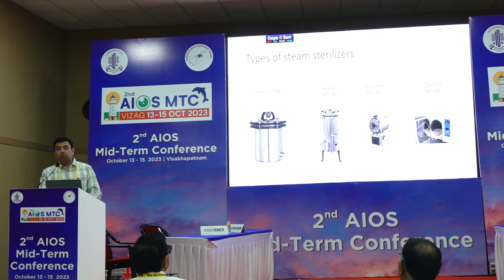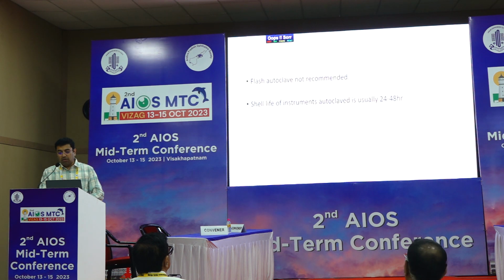So the B class autoclave is very highly recommended. If you are doing phaco on a regular basis, then it is better you sterilize your phaco tubings in a B class autoclave. A flash autoclave is not recommended.